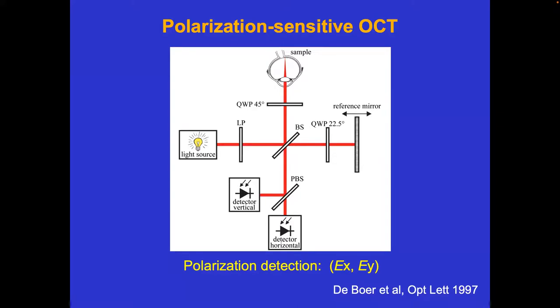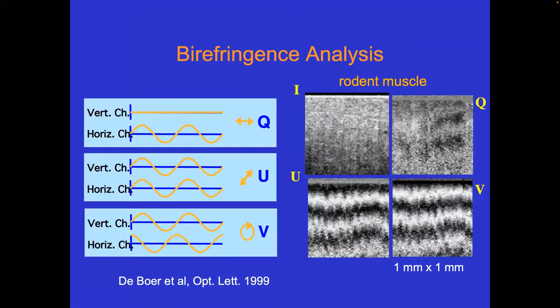If these two have a quarter of a wave phase, my intuition: the reference and this reference are a quarter of a wave out of phase, but your interference is exactly in phase. Then the original sample arm light must also have that quarter of a wave out of phase pattern, otherwise it won't generate that. So when I say I can measure the polarization state from my sample, that's not quite true. We work around this.